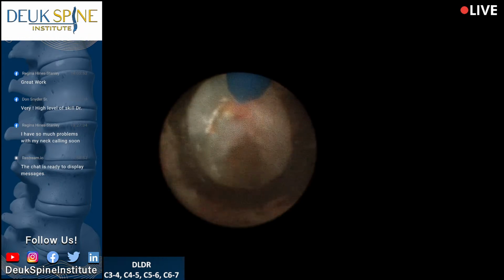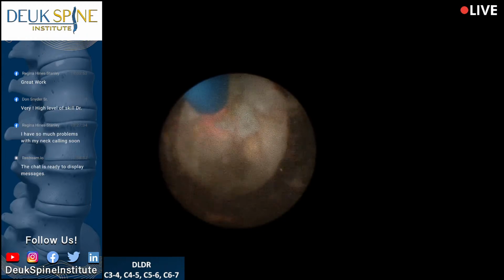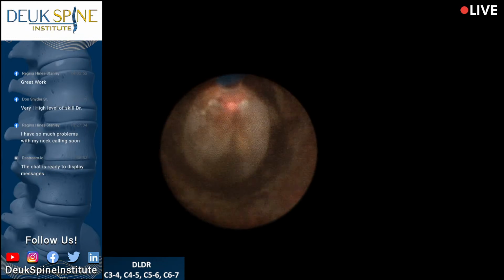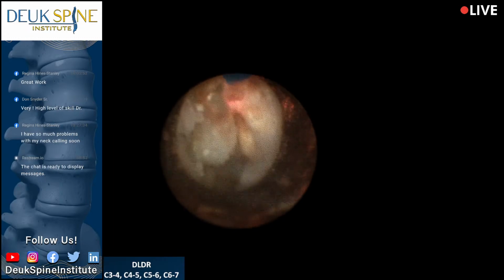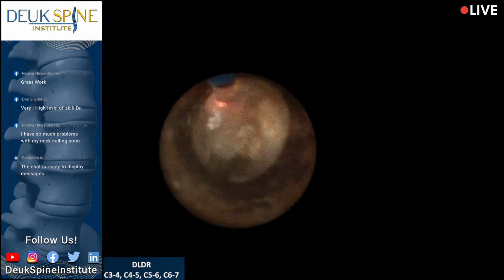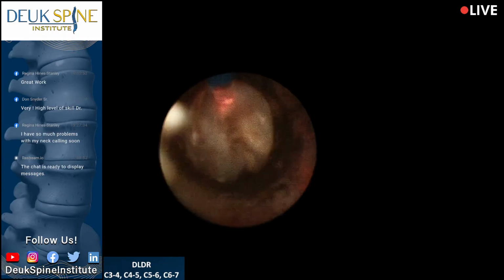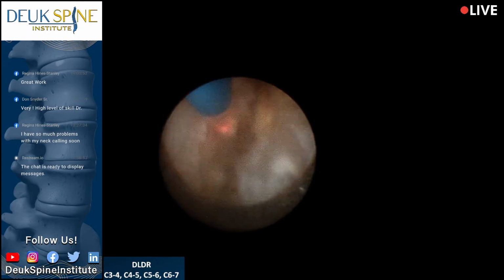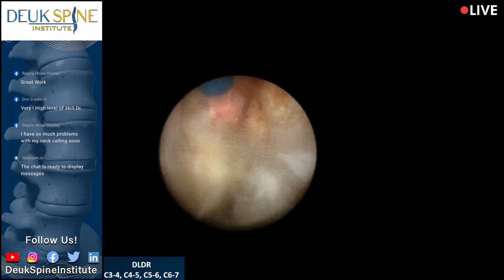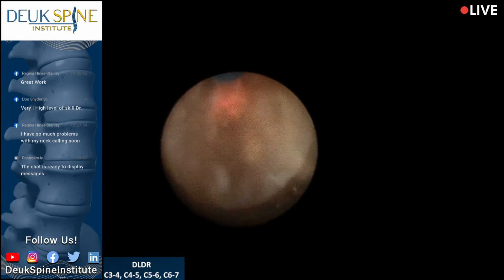Easy. And then we saw some fresh herniation. So the really old herniated nucleus pulposus, it won't stain blue. But the fresh stuff does. Look at that fresh piece right there coming out of the hole. So you got a mixture of old, like 30 years old, 40 years old, and you got new. This is a giant wad of herniation right there. We're going to have to work on getting out.